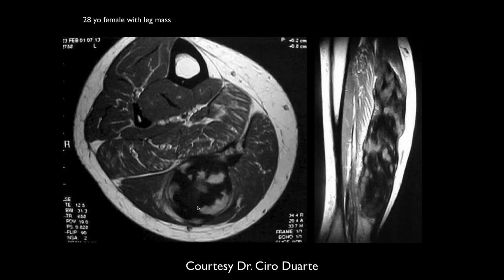So we have a 28-year-old female with leg mass. We have T1 images in axial and in the sagittal plane. Along the posterior musculature, I'm seeing a very ill-defined heterogeneous area with mixed density components, basically hypointense with multiple interspersed hyperintense foci. And I see them extending all along the posterior musculature in these sagittal images. With no history of trauma or with history of trauma, I think the differentials would be different.